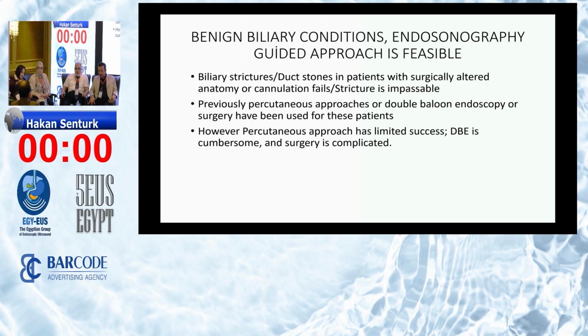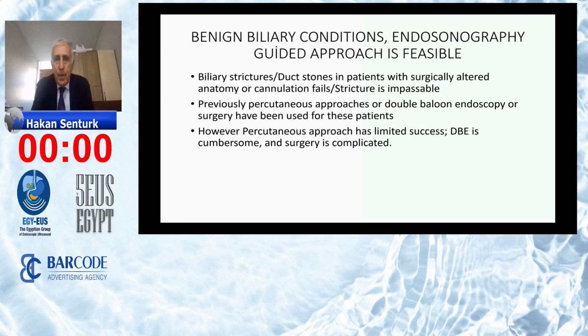Benign biliary conditions requiring endosonography guided approach are biliary strictures, duct stones in patients with surgically altered anatomy. Previously, percutaneous approaches or double balloon endoscopy or surgery have been used for these patients. But every one of these approaches has its own drawbacks.